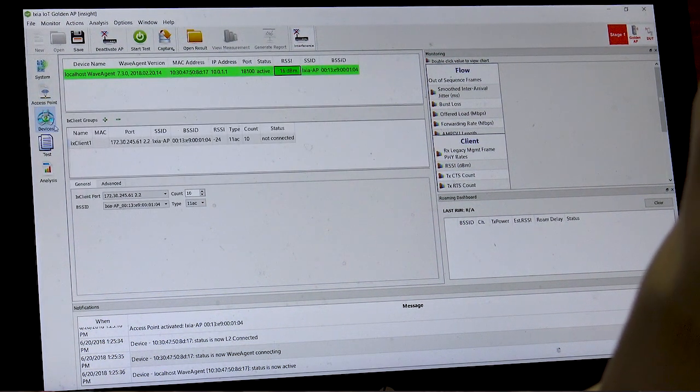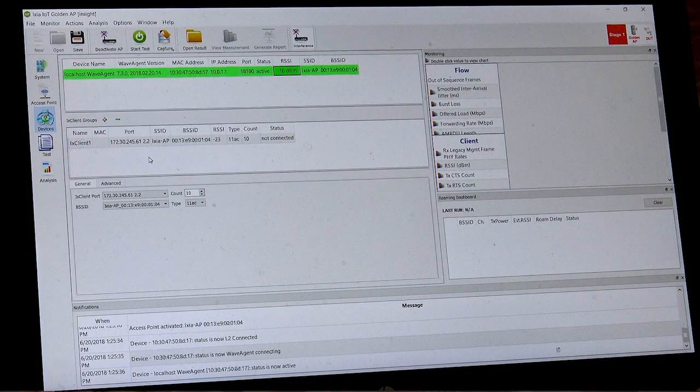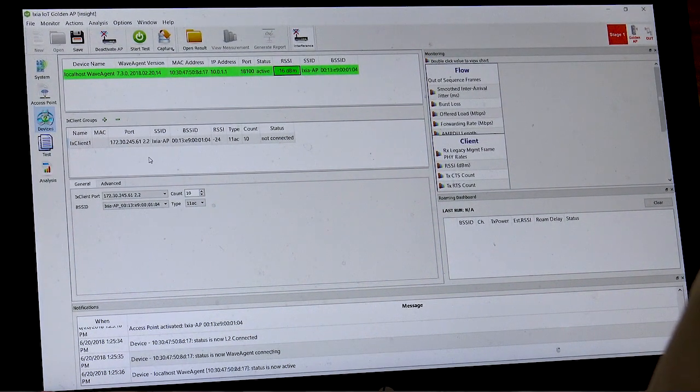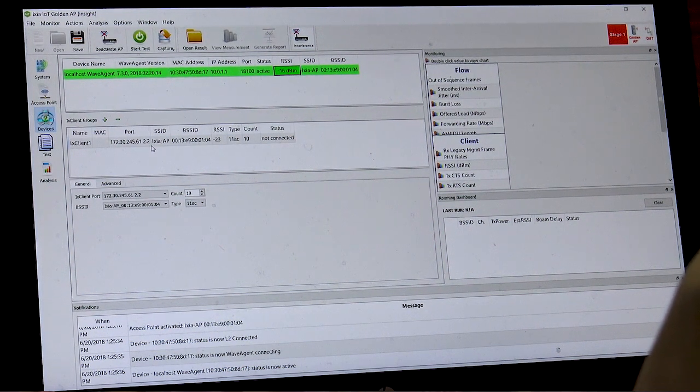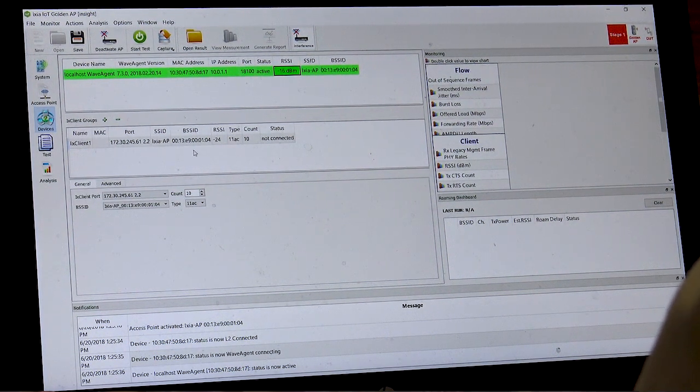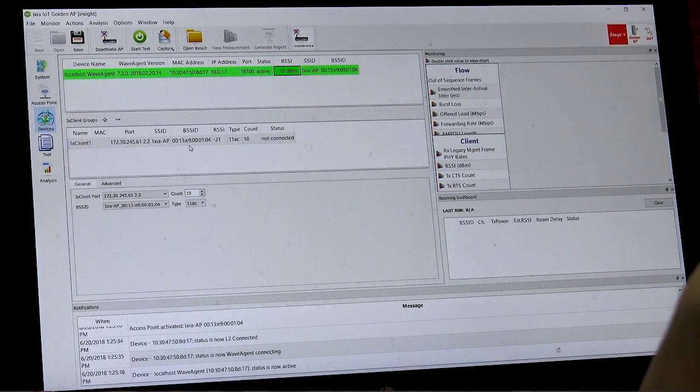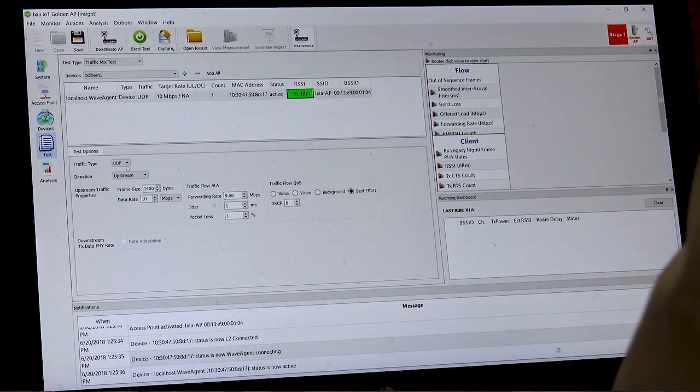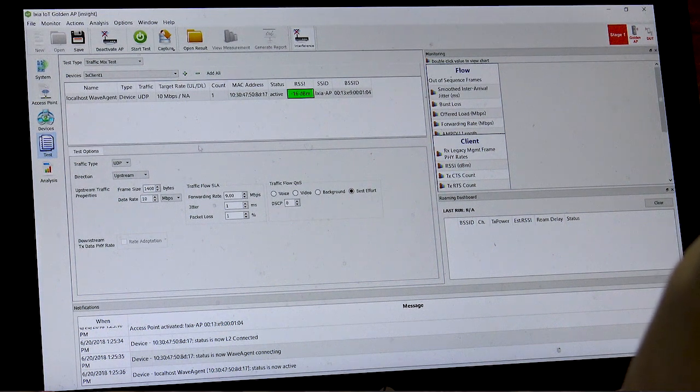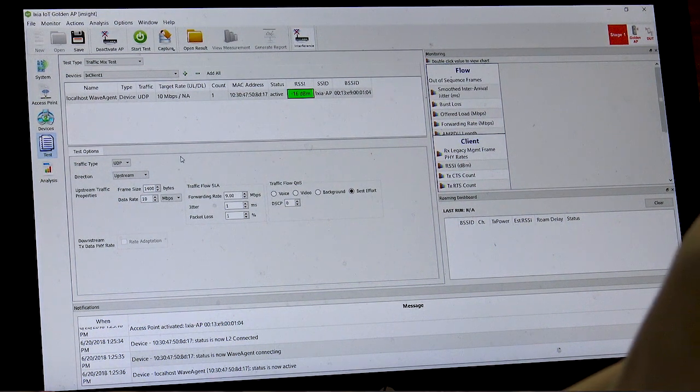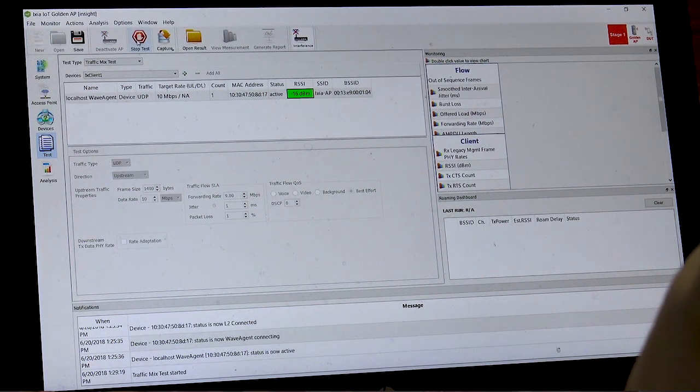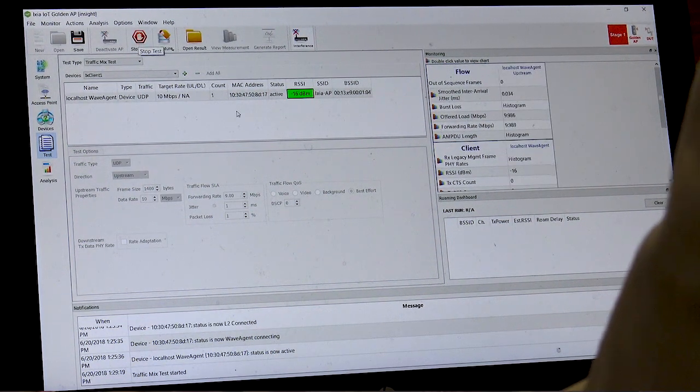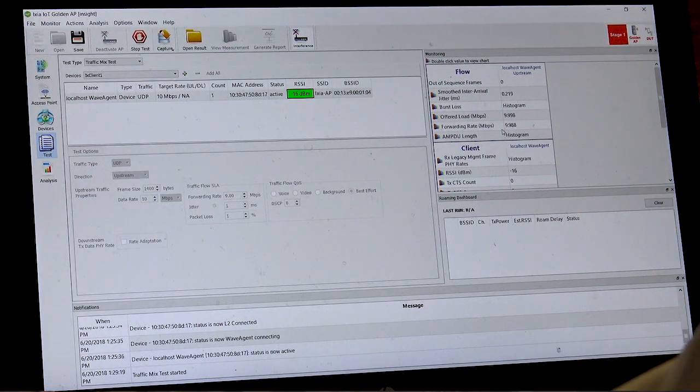We can also add in devices, both our medical device that's under test as well as competing other devices and we can choose the number of devices in client type. In this first test, we'll run a throughput test and we can choose the target rate for the medical device. Starting the test, you're able to see the throughput in real time.